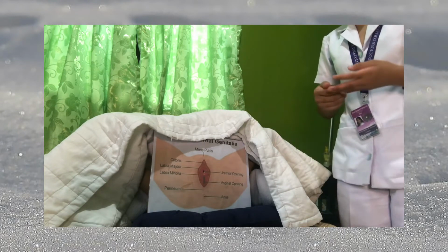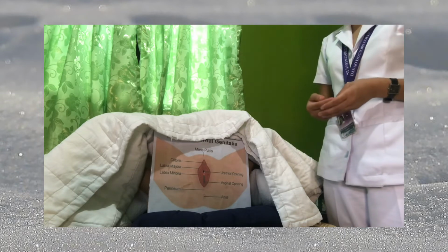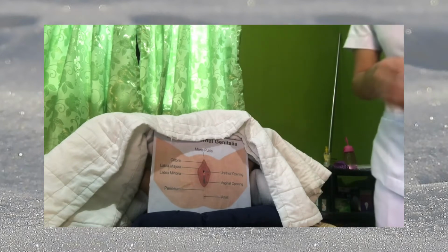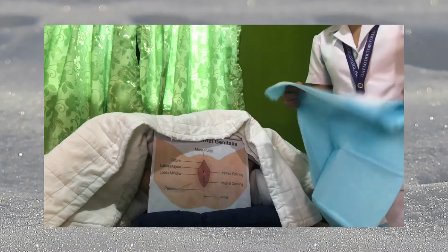The second step is to open the tray and arrange the equipment for convenience and to avoid contamination of the sterile items. This is done to increase the speed of the performance.